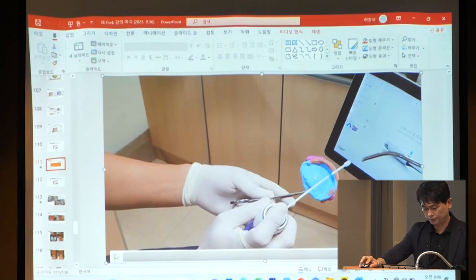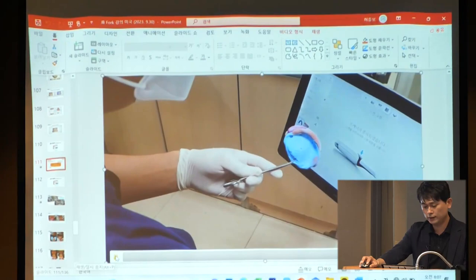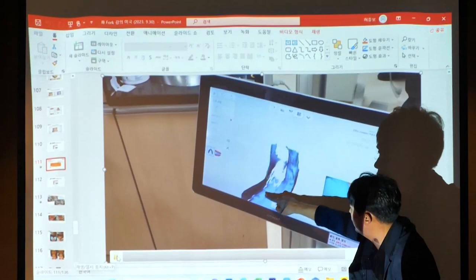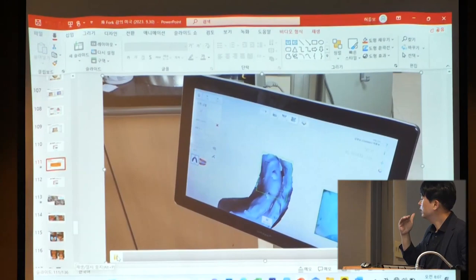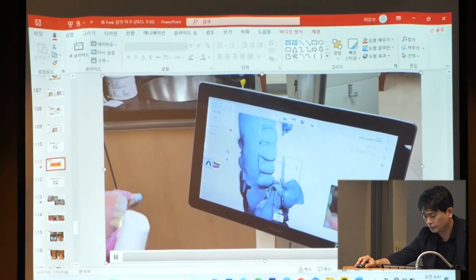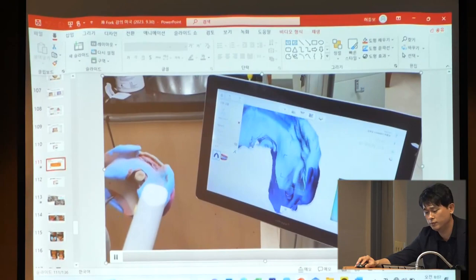After spraying the powder to prevent bright reflection, scan directly. You can see the reference points like this, here and here. That indicator is from the resin tag in the oral cavity. I scan it. This procedure will be done by the oral hygienist or your assistant. It's a very simple procedure. It's not your duty.